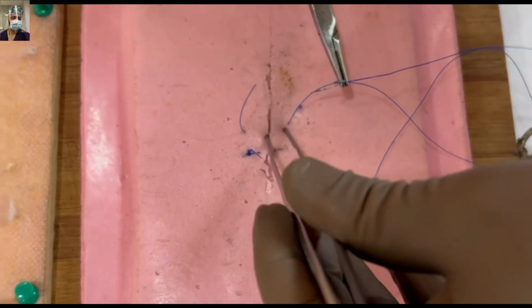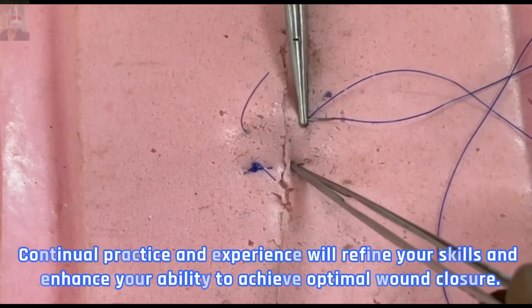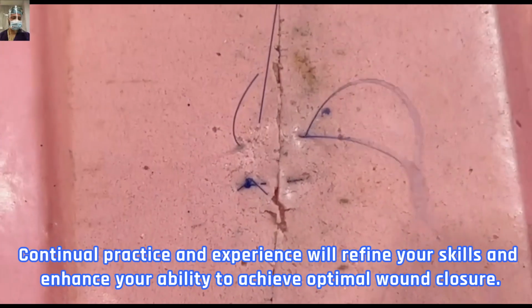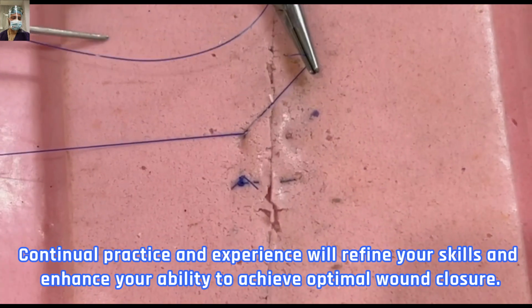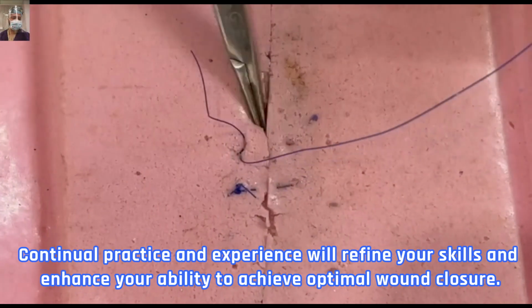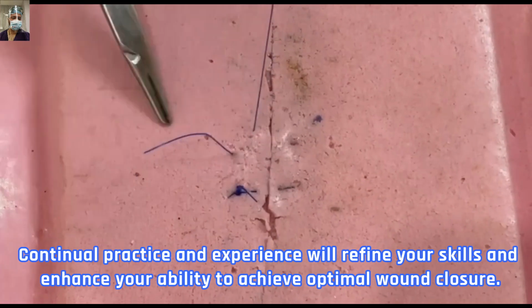So for the sake of demonstration, if I am taking too much tissue and going against the lay down principle, that I pass the needle through both the edges at the same time, and again I am not in the same vertical or horizontal plane, it is different. So this will create a sort of strangulation, and it is undesirable. The whole aim of the vertical mattress suture is then defeated.